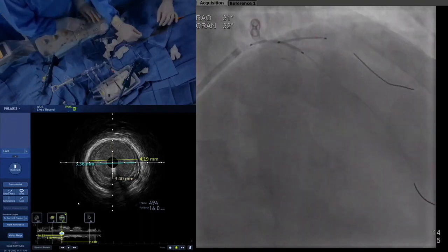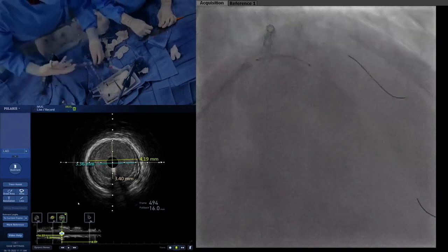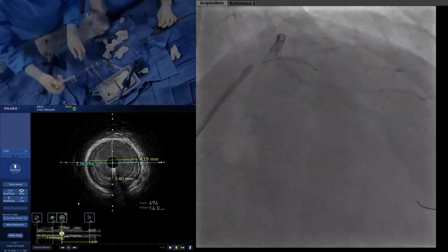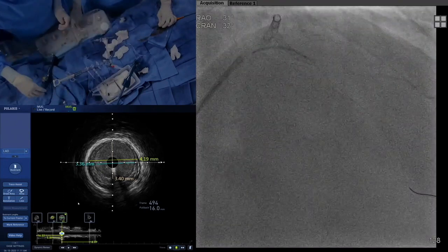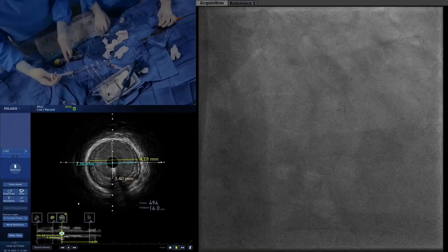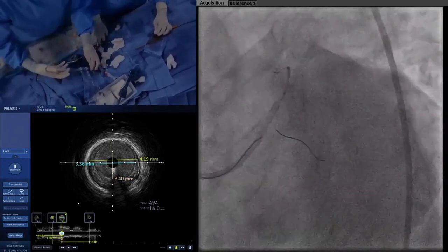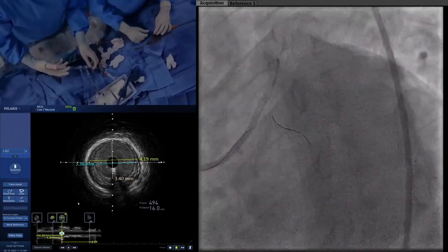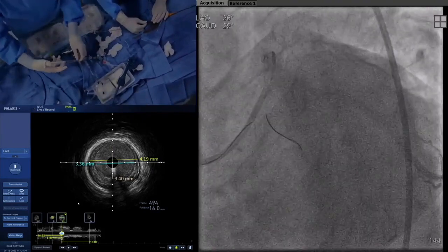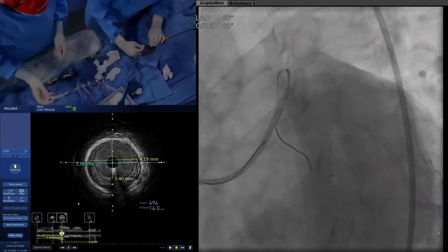It looks okay, but it looks a little bit like you're going across. To Greg's point about not having any data, sometimes it's just a practical concern about the anatomy. The closer you are to 90 degrees, the more likely you can nail the ostium. The shallower the angle, you have to have an obligatory overhang. So you might as well just cover the distal part of the left main. But it was important to do the IVUS now, because often the left main is involved, even if it doesn't look involved angiographically. It's involved until you prove otherwise. Take a cine. Going up.